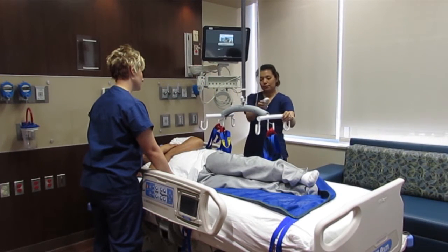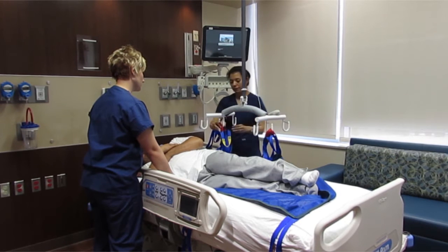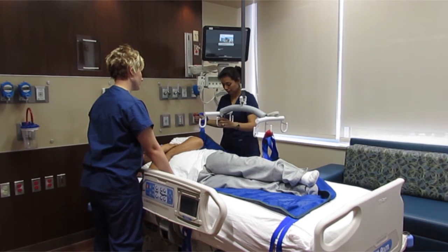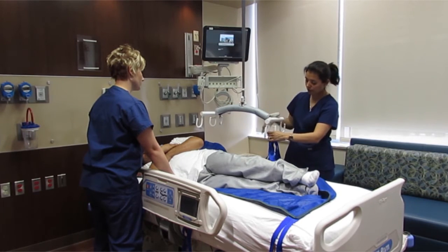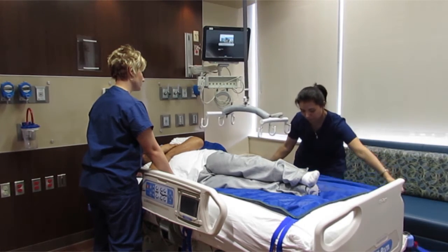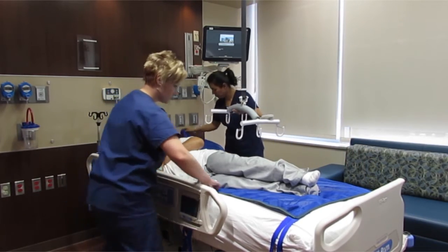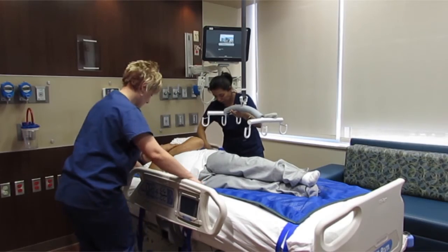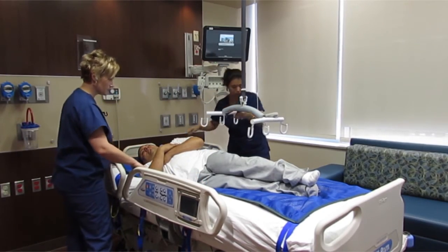Once the task is complete, lower the lift down in order to disconnect the sling from the spreader bars as shown. Be sure to straighten out the sling, removing any wrinkles under the patient and make sure there are no straps laying under the patient. Finally, raise the bed rail for safety if needed.